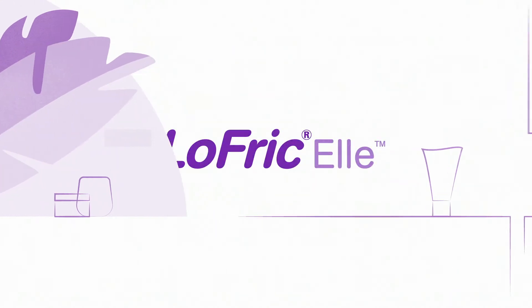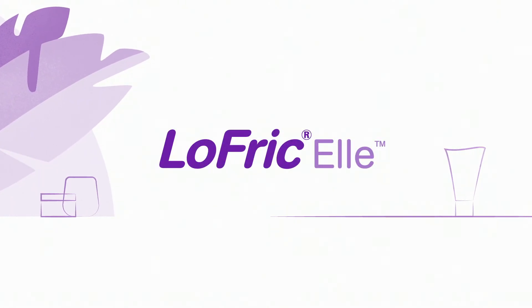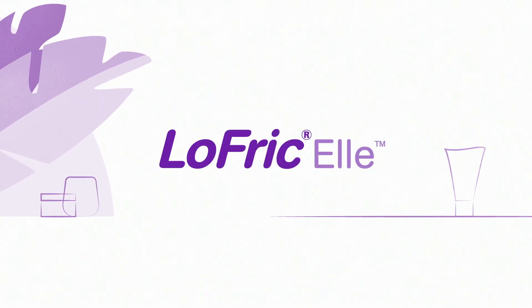LoFric Elle — your versatile single-use urinary catheter. Ready for you, whatever your lifestyle needs.